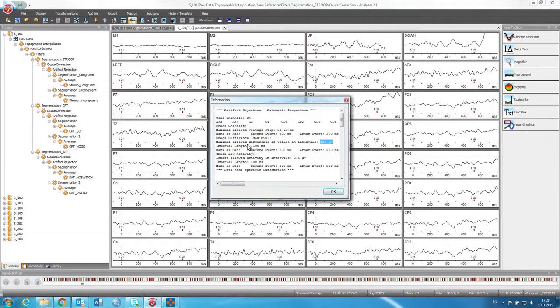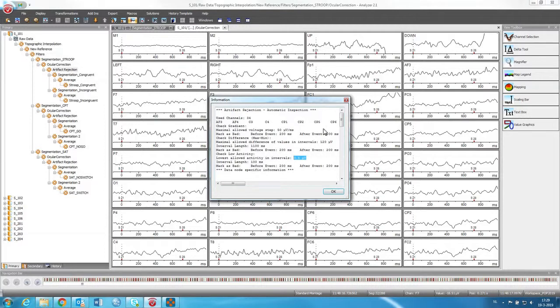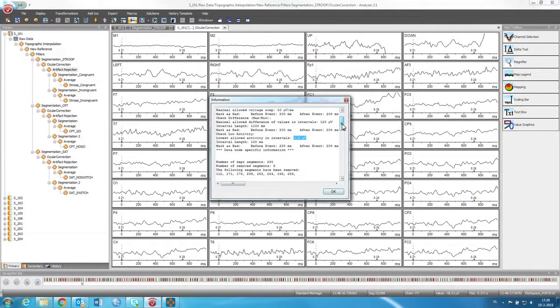Then we also have maximum allowed difference of values in an interval. So over the interval of the length of the epoch, there cannot be a voltage difference of 120. Also, some other things, there's also kind of like lowest allowed activity in intervals.